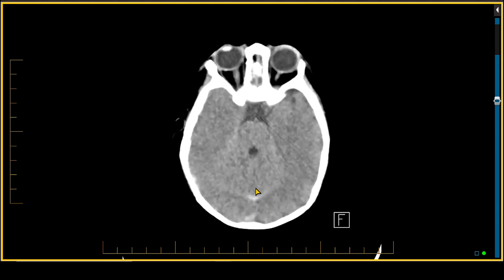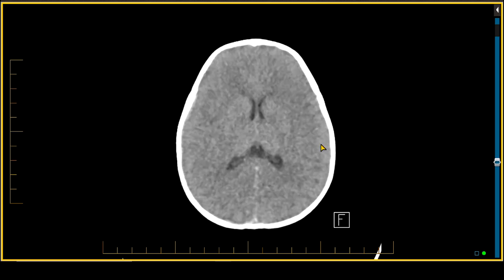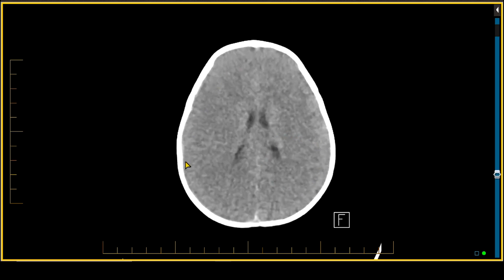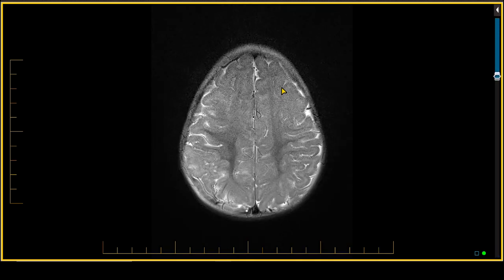One of the findings noted on this case was the fact that there seemed to be some element of a loss of the gray-white differentiation. It doesn't seem like we can separate good quality gray matter from the white matter, and this had a bland appearance to it. For that reason, the patient was recommended for MRI scanning. This is the MRI scan of the patient, which was performed on the same day.